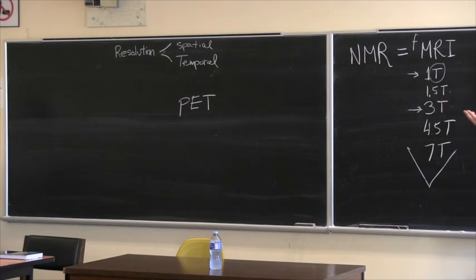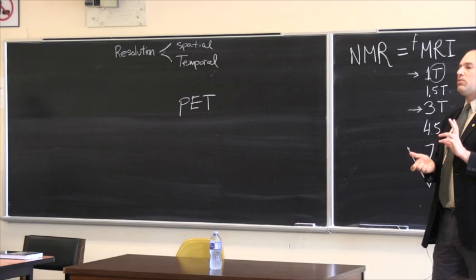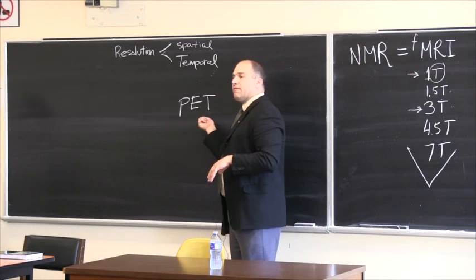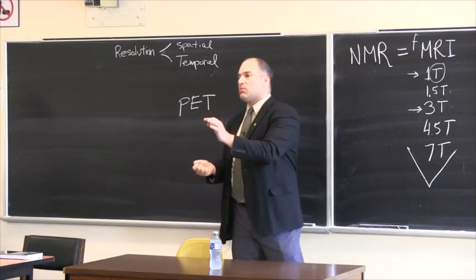Tomography is just a fancy word to say we're going to take plenty of two-dimensional images and make them into a three-dimensional rendering. So that's the tomography that we're talking about. There's a particular physical phenomenon that we're exploiting here, and that is that when you have a radioactive material in your body, it decays.